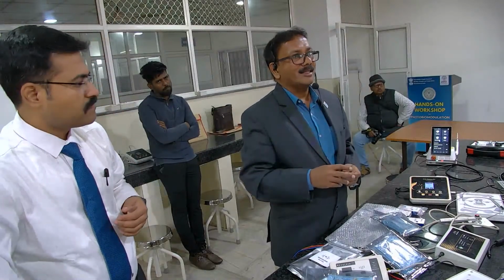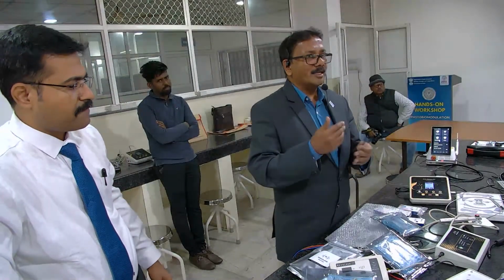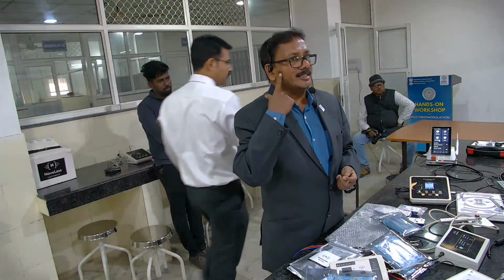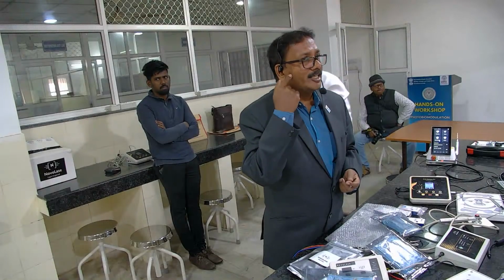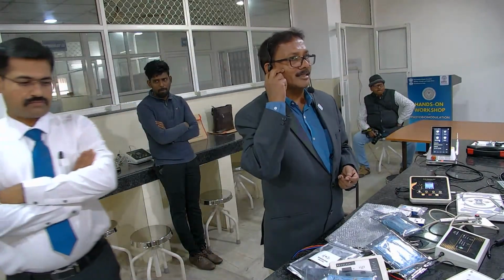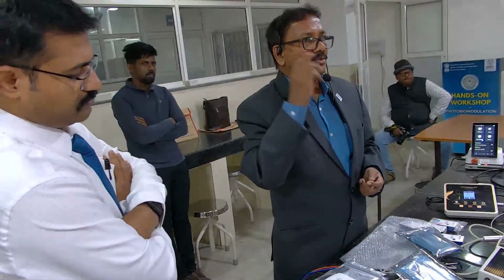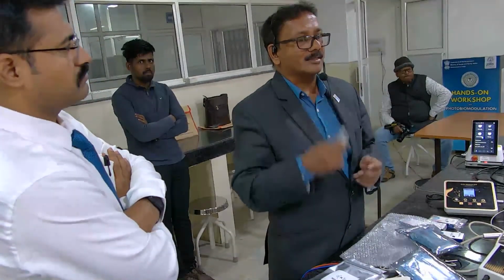Patients demand something for TMJ, but you need to understand the science a little. TMJ is deeply seated, right? So you want the energy to go very deep into the tissues. If you're using the TMJ cluster, it will be like this, 10 mm, 12 mm. So the energy delivered will not be the same as what you deliver here.